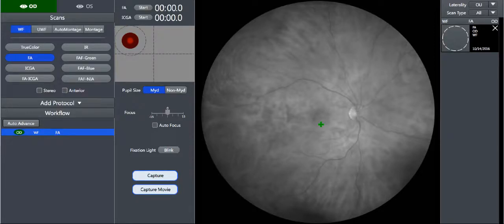This is a video demonstration of a prototype I created as part of my design process for a new eye imaging device for Zeiss Meditec. This simulated system was created using Axure and was used for sales demonstrations, user testing, communicating the system function and look and feel to developers, and by the quality assurance team for system validation. Let me explain a few parts of the system.